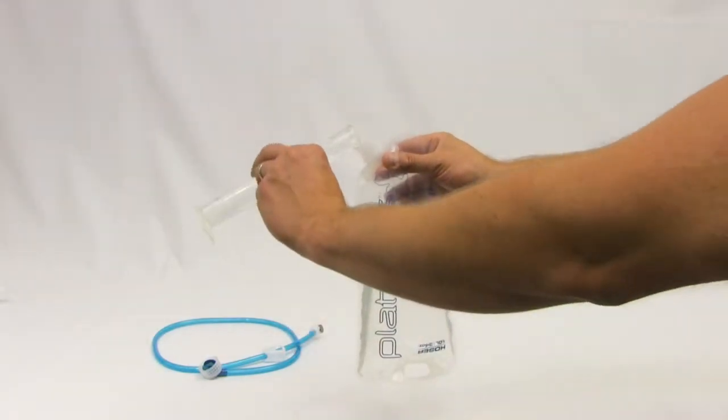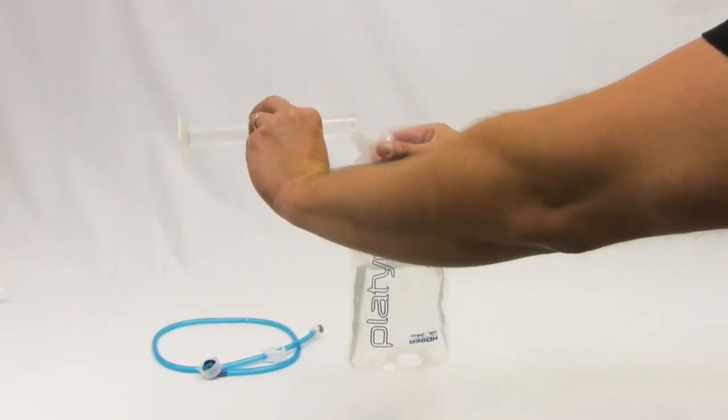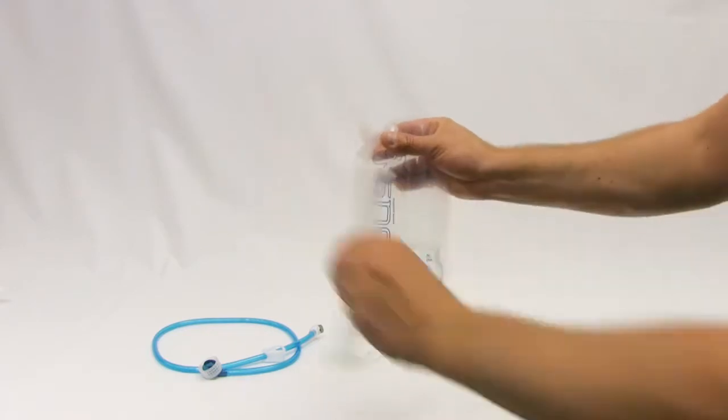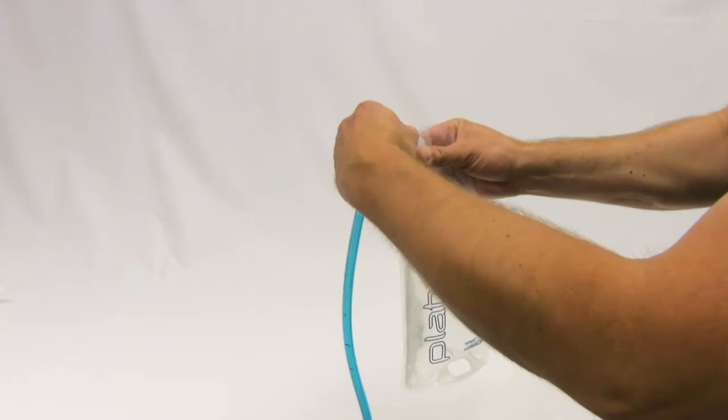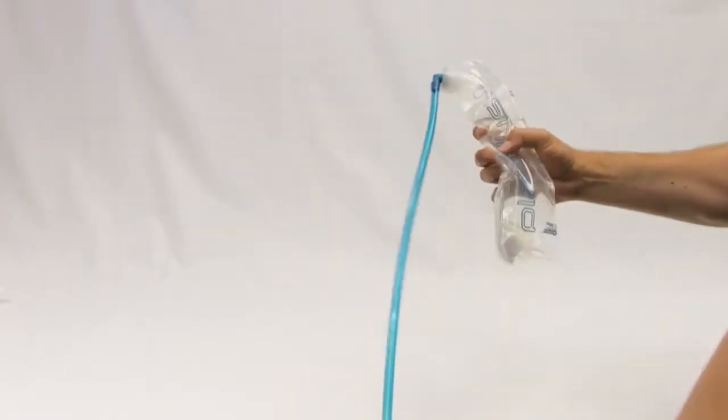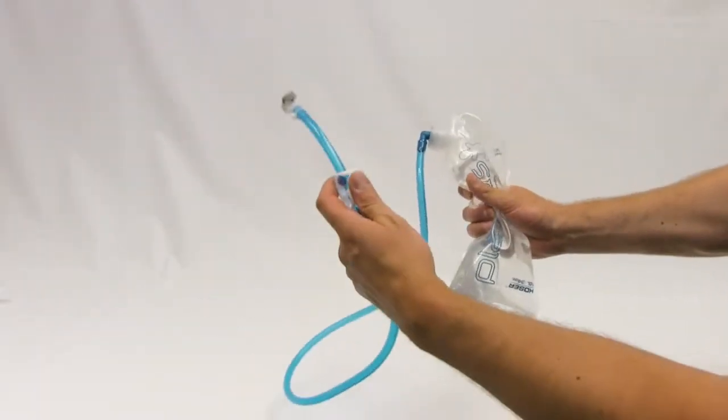Obtain a pressure infusion bag, bladder, and extension line. Fill the bladder approximately half full with colored or clear water, then reattach the extension line to the bladder. Open the clip, purge as much air as you can from the bladder, and then close the clip.